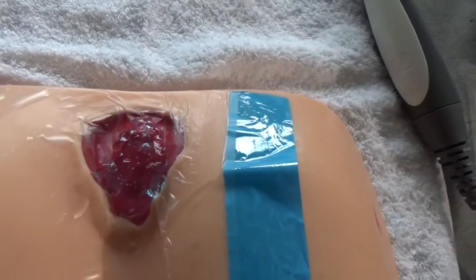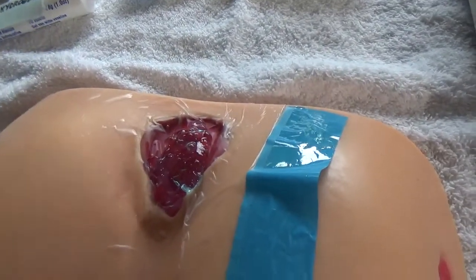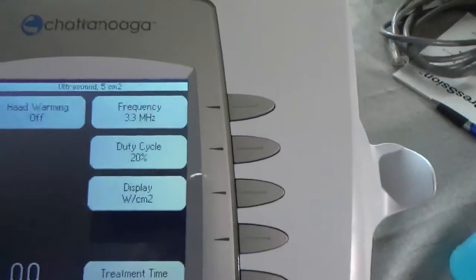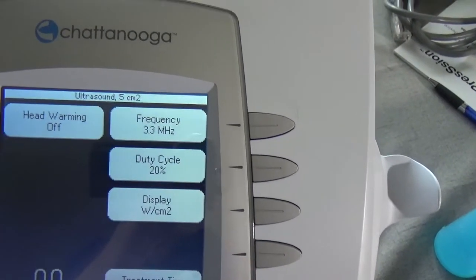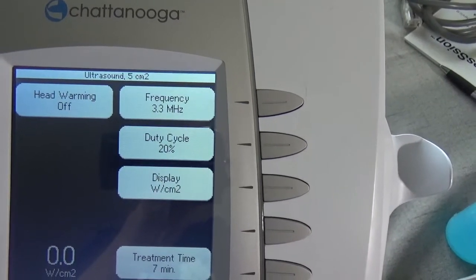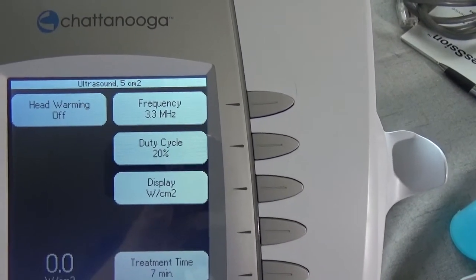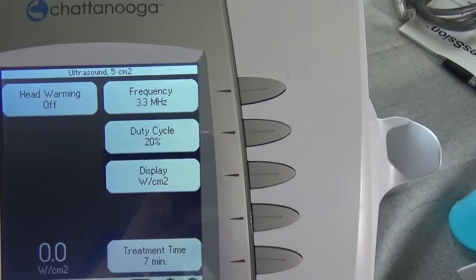You can kind of see that now. We'll come over to our unit because now we're ultrasounding through an area with no skin, and we have 3.3. Some units will say 3. Chattanooga's is 3.3 for their ultrasound. If you're just going superficial on the ultrasound around the wound in the separate video, you can also use 3.3.